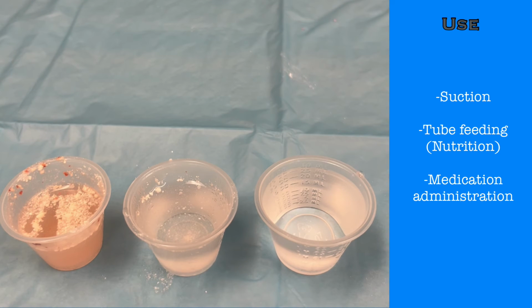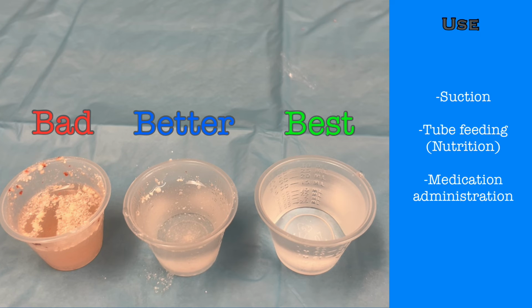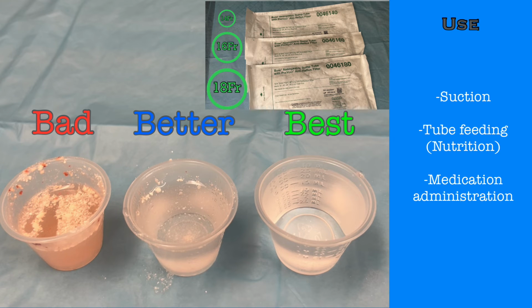All medications must be thoroughly crushed and dissolved in water. You do not want to risk clogging the NG tube you just worked so hard to place. The larger the French, the larger the tube, and the less likely it will clog. Anytime you will be injecting medications or infusing tube feeding, make sure to flush the tube with at least 30 milliliters of water after use to ensure all meds or feeding are cleared from the tube and to prevent clogging.